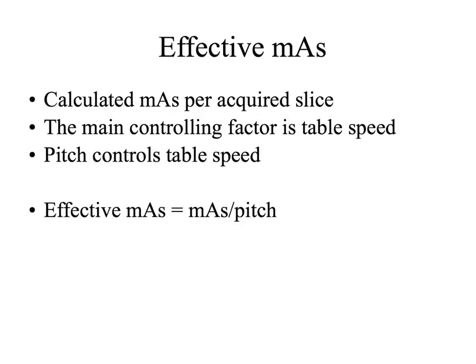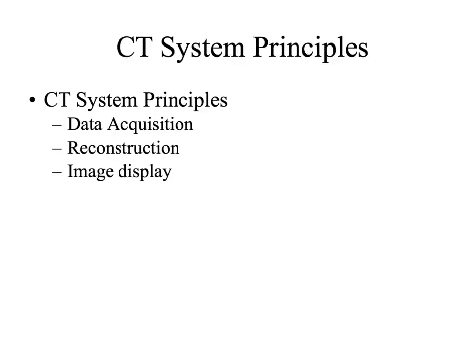So basically what it's saying is the amount of time it took me to spin the tube around, applied in milliamperes, right? Milliampere seconds, linked with this movement of the table along the z-axis, right? So that's what this formula is giving me right here, right? It's tying the dosage to time and table movement, okay? And I promise you, we're going to make that super exciting by the end of this day.